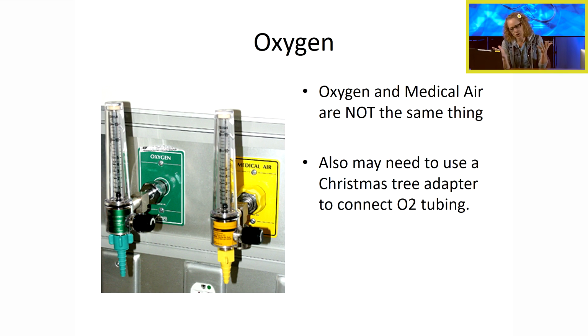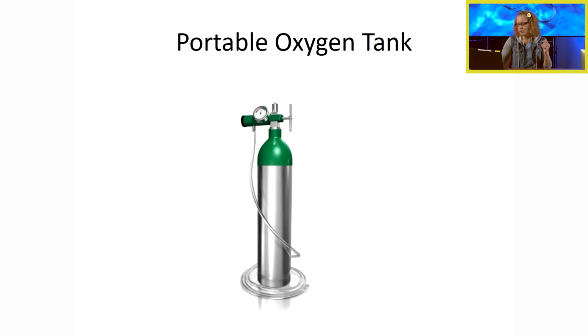If anybody tells you to go get one, it might be needed emergently, so you better know how to find it and you better know what it looks like. So there you go, Christmas tree.